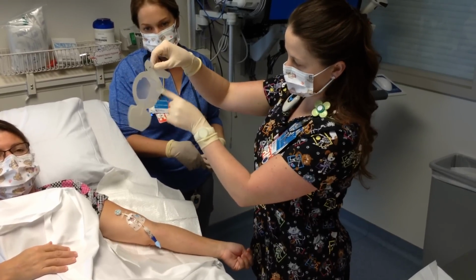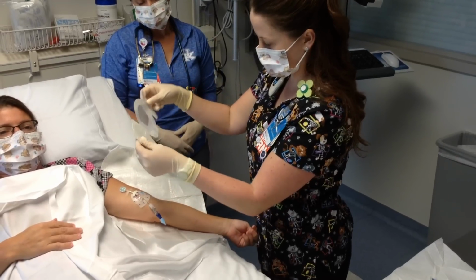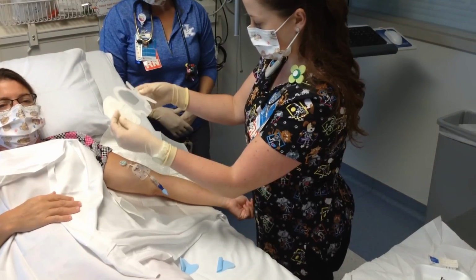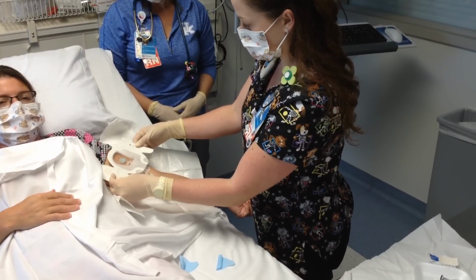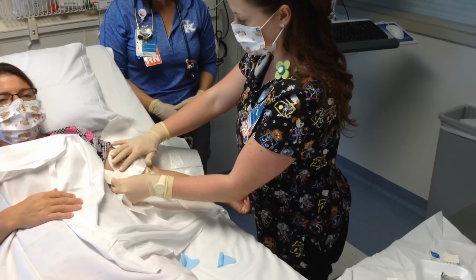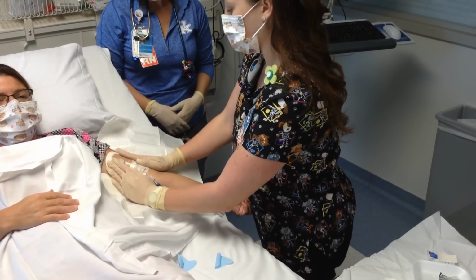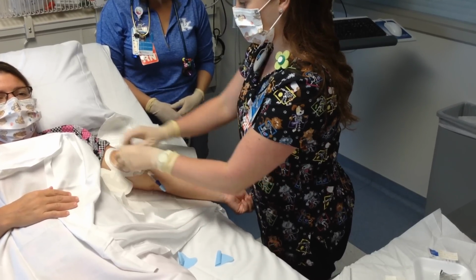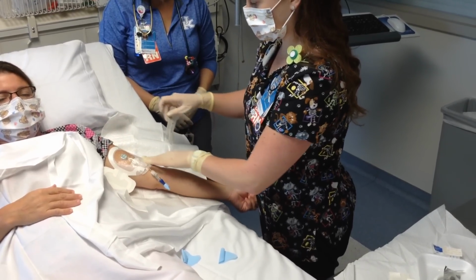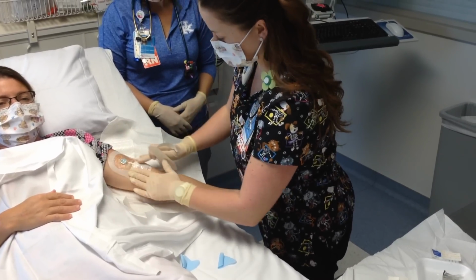The end of our dressing here will line up with the end of our clear part of our securement device. So part of your securement does still stick out. This 3M you can lay down flat, you don't need to stretch it. Make sure it's positioned where your biopatch and insertion site is as close to the center of it as possible. Lay it down flat without stretching it. Your side piece will come off, using the warmth of my hand. Your other side piece will come off, making sure it sticks well.